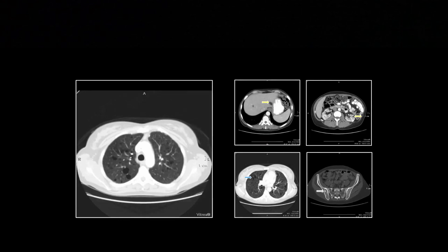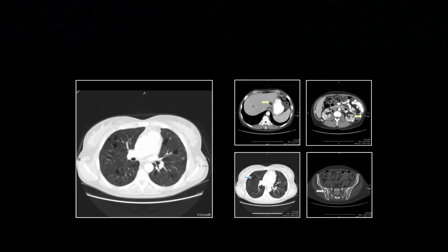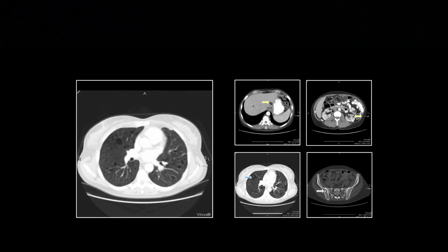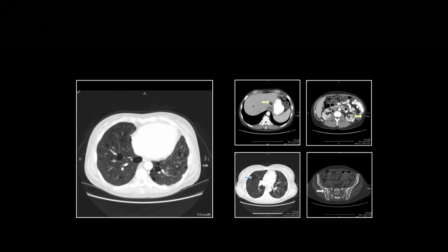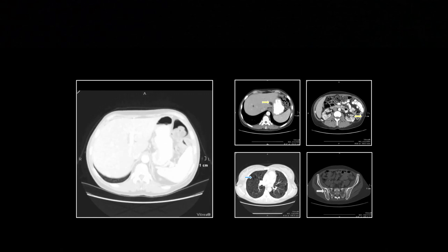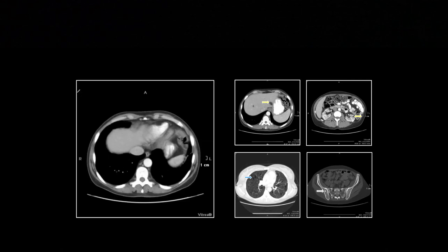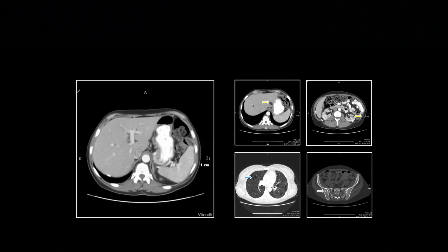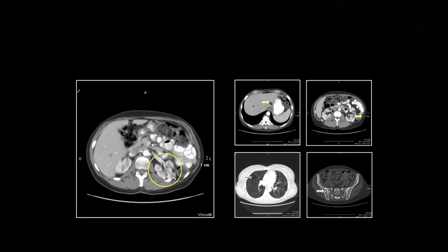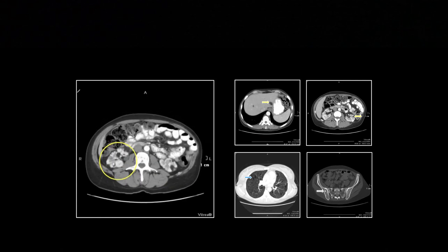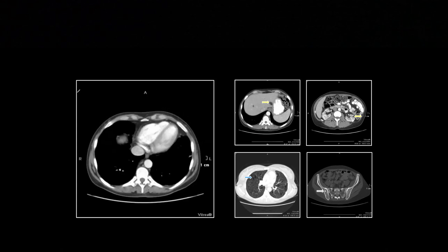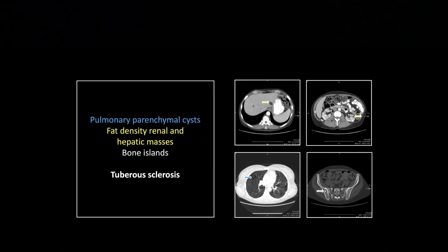So here's the LAM. The cysts are a little larger than in EG, but otherwise kind of similar in appearance — again, no wall to them. So all those liver lesions, the renal angiomyolipomas, and the bone islands: a case of tuberous sclerosis with LAM.